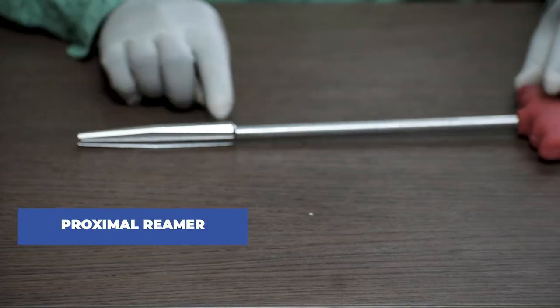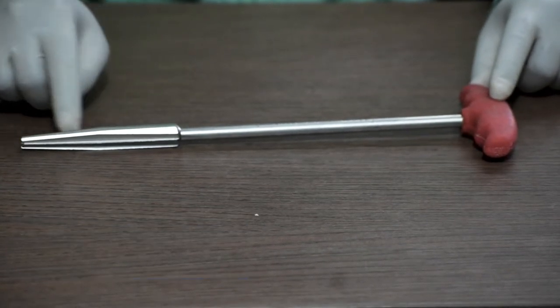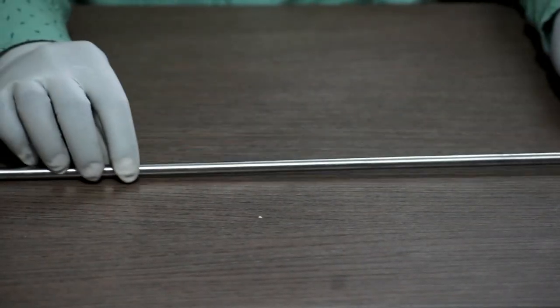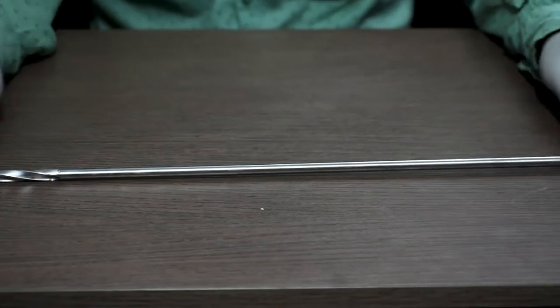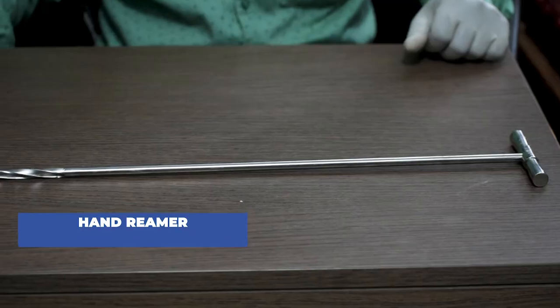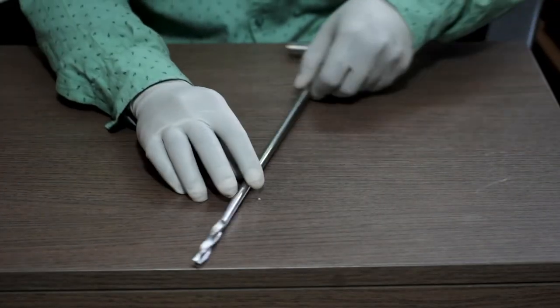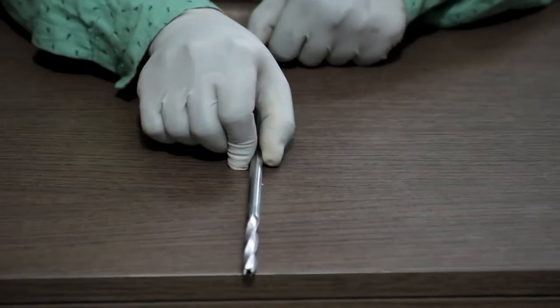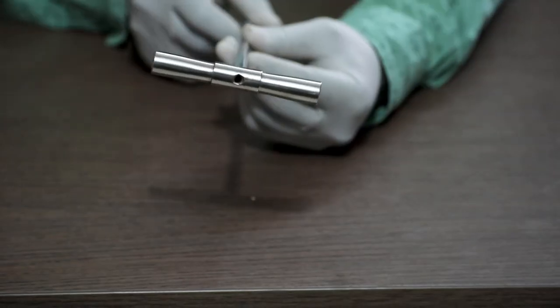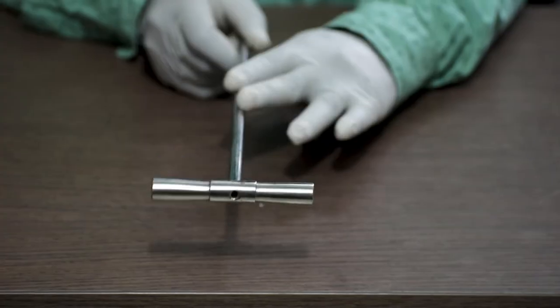This is a proximal reamer. The diameter of this proximal part is 15 mm. Next, this is a hand reamer. This is a cannulated one. Available with the diameter of 8 mm, 9 mm, 10 mm, 11 mm and 12 mm.